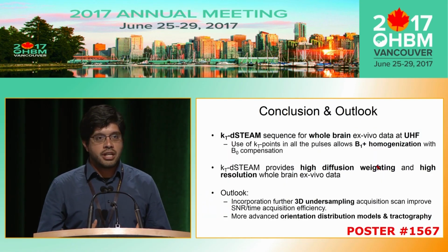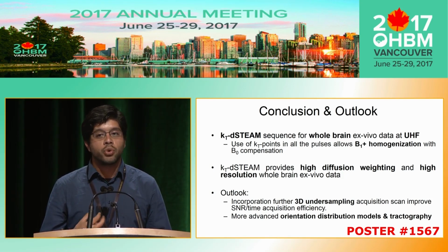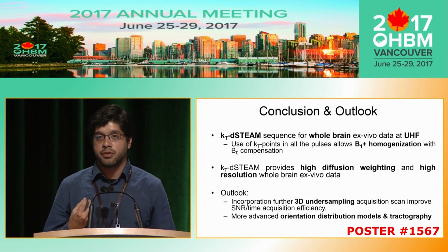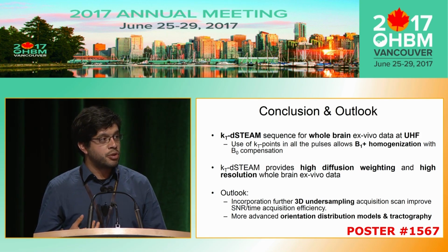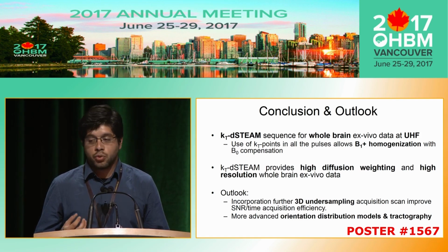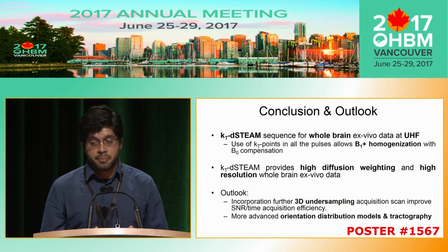So as conclusion, and that is the message I want to give you now in this talk, is first, we can use the STEAM sequence in ultra-high field scanners and take the advantages that that sequence offers for diffusion by the incorporation of the kT points to avoid inhomogeneity problems, as I showed before. Also, this sequence allows us to get high diffusion weight and a high resolution whole brain ex vivo data.